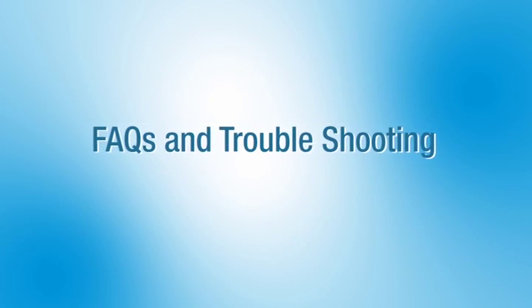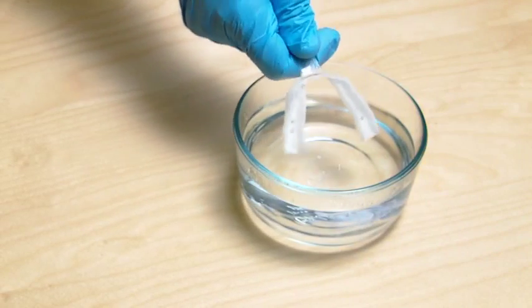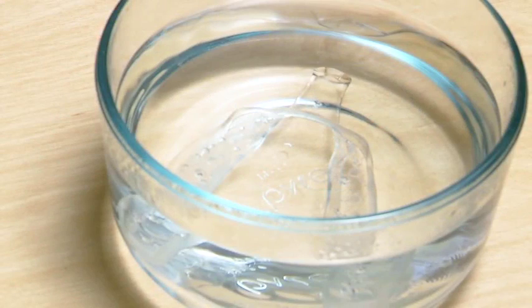Frequently asked questions in troubleshooting. If adjustments need to be made to the trays, you can repeat the boiling and fitting process. This can be performed as many times as needed. The trays will return to their original shape when heated.